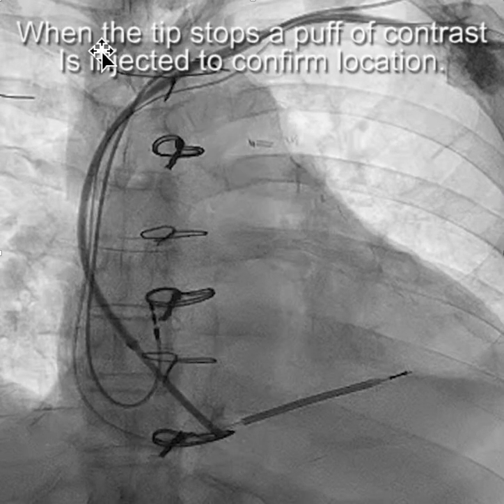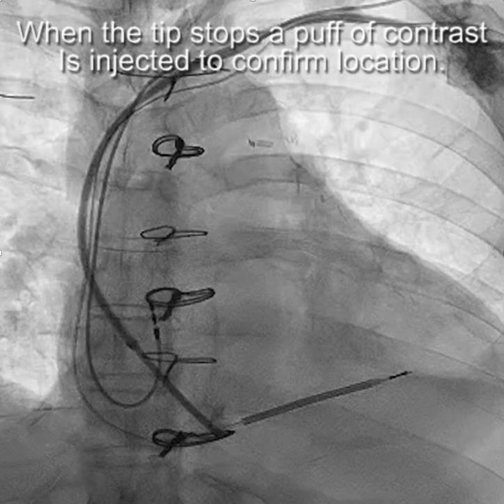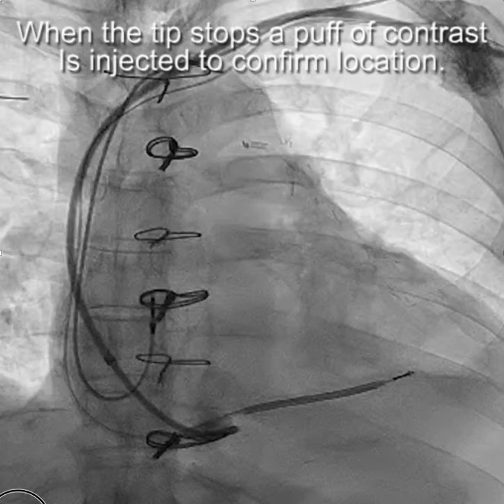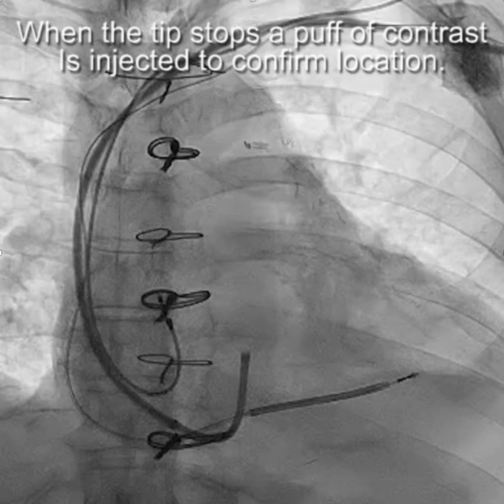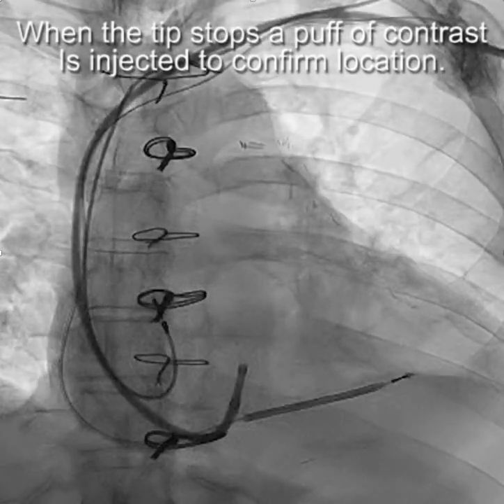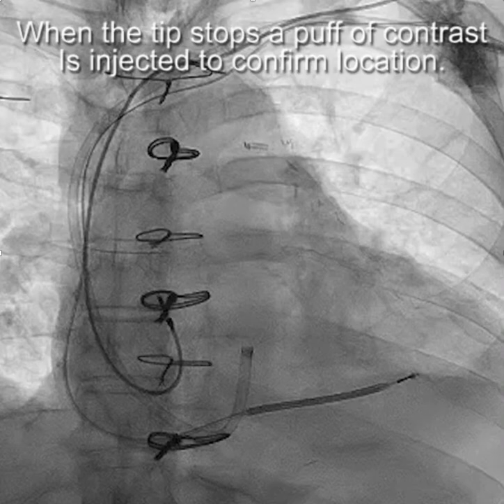I hope you saw that tip drop. When the tip stops dropping, a puff of contrast is injected to confirm the location. Usually, if there are no side branches that engage the braided core, we just advance the braided core into the coronary sinus, and then advance the sheath over the braided core.